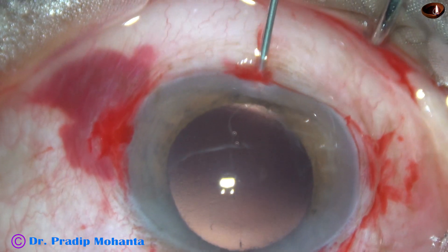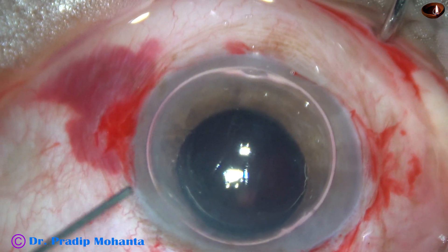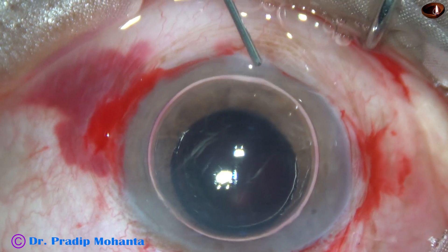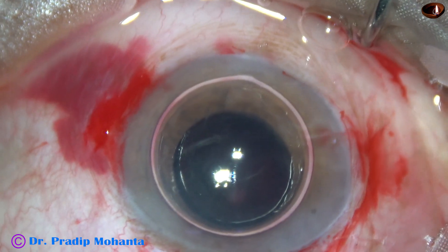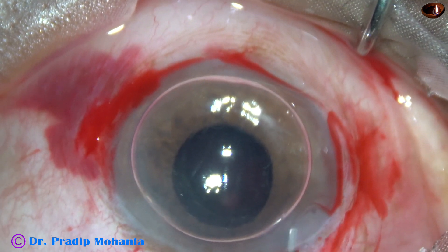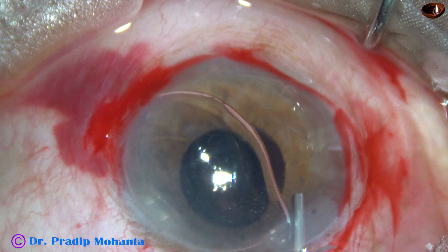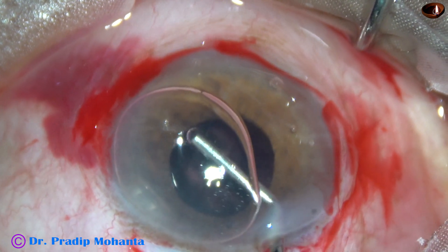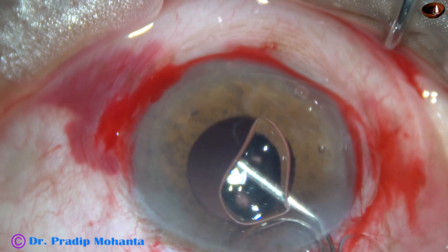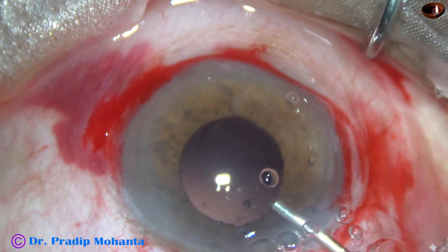Now an air bubble is injected, and then pilocarpine is instilled — pilocarpine is administered into the anterior chamber onto the iris. And the pupil starts constricting. And now viscoelastic is injected into the anterior chamber. The air bubble is replaced by viscoelastic. It is done very gently, and still the anterior vitreous face is intact.